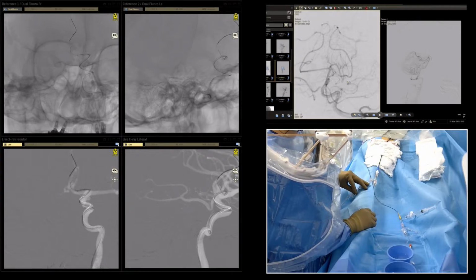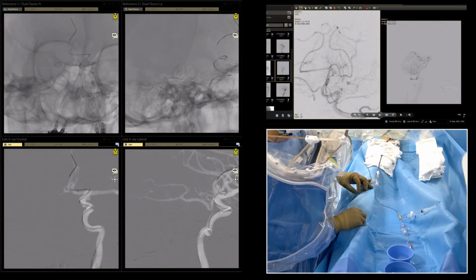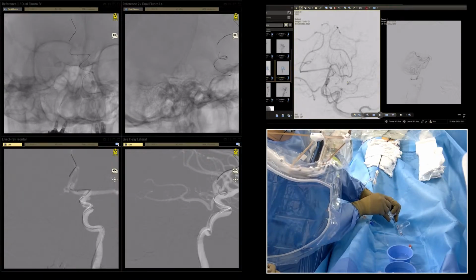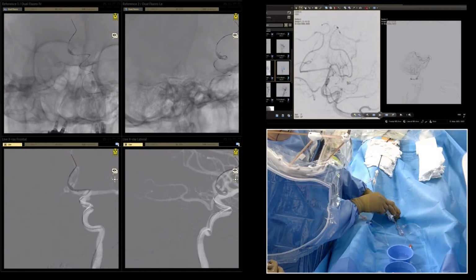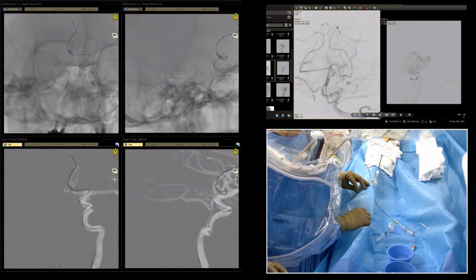Okay. Let's navigate. It looks like it's quite soft. It's softer than Scepter, I think. Chikai Black, I think, is a little bit stiffer. This one is softer. Yes, it's soft.